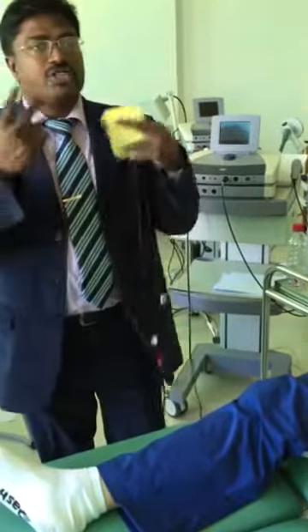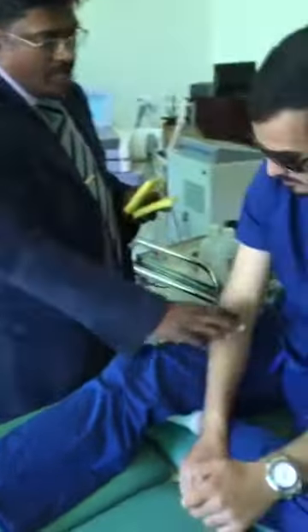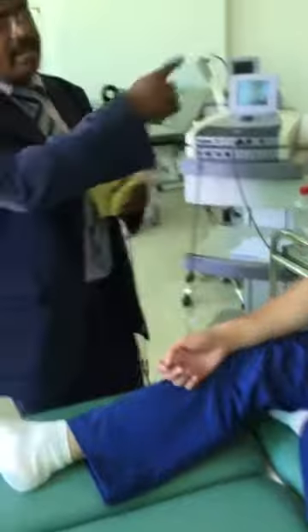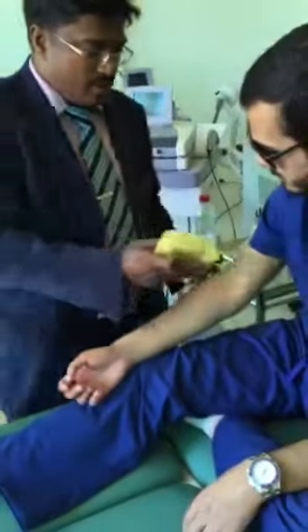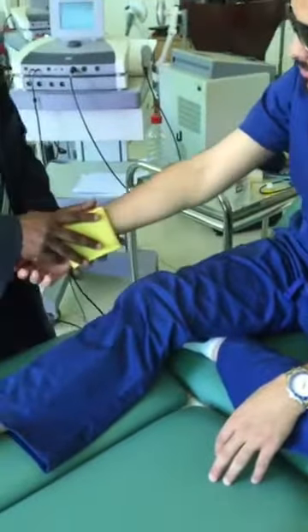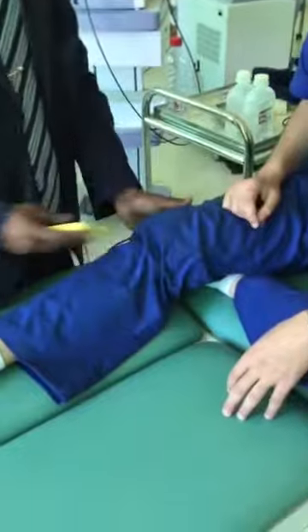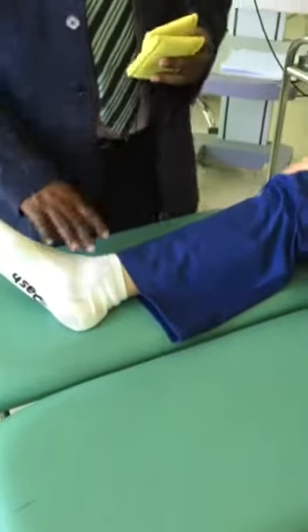If it is a joint — for example, elbow joint or wrist joint — and the joint is the problem, then you can use four electrodes or two electrodes and keep them around the joint. For the elbow, wrist, knee, or ankle, you keep the electrodes around the joint. So if there is joint pain, you keep the electrodes around the joint.